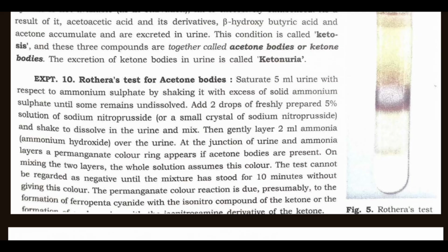At the junction of urine and ammonia layer a permanganate color ring appears. If acetone bodies are present, on mixing the two layers, the whole solution assumes this color. The test cannot be regarded as negative until the mixture has stood for 10 minutes.